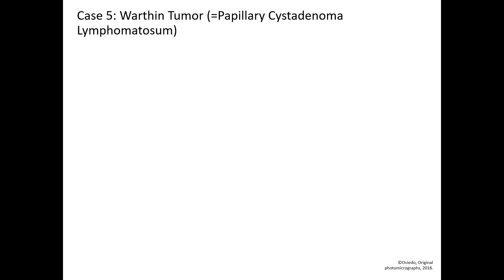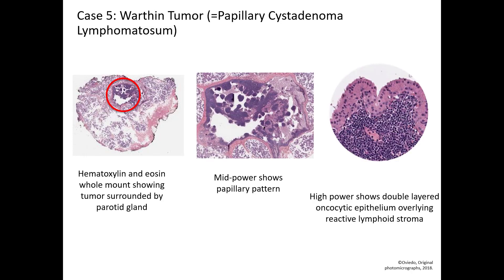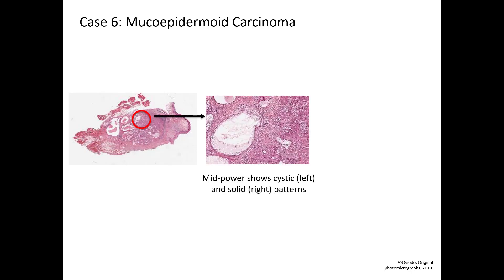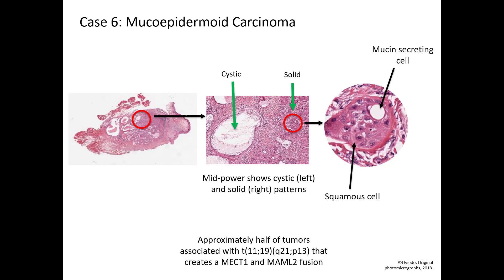Case 5 is Warthin tumor, the same as papillary cystadenoma lymphomatosum. The mid-power shows the papillary pattern. On the right, you can see the oncocytic epithelium and the reactive lymphoid stroma. Case 6 is mucoepidermoid carcinoma — the mid-power demonstrates cystic and solid patterns. On higher power, here is a mucin-secreting cell and here is a squamous cell. Approximately half of mucoepidermoid carcinomas have an 11-19 translocation creating a MECT1-MAML2 fusion.